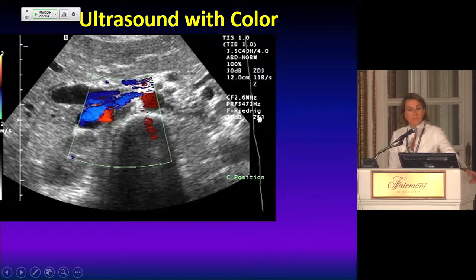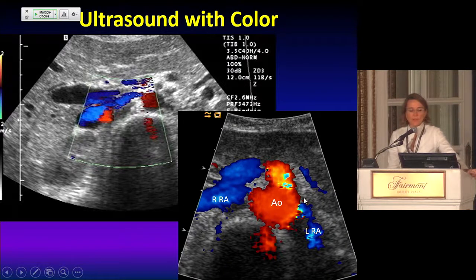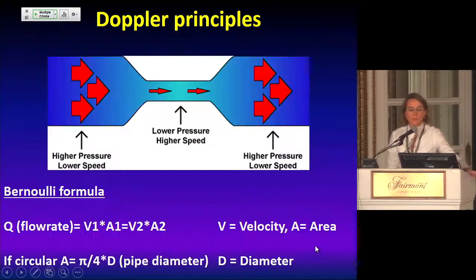In these situations, you do apply color to actually see the vessels more by the blood flow that is represented there. And just to remind you, color Doppler shows you direction: red is usually coding for flow towards the probe, blue flow away from the probe. It's not telling you artery or vein, it's just the flow direction. And this is how you see the aorta with the right renal artery first going a little bit up towards the probe. That's why it's red, and then it becomes blue. And this is the left renal artery, which is typically blue.